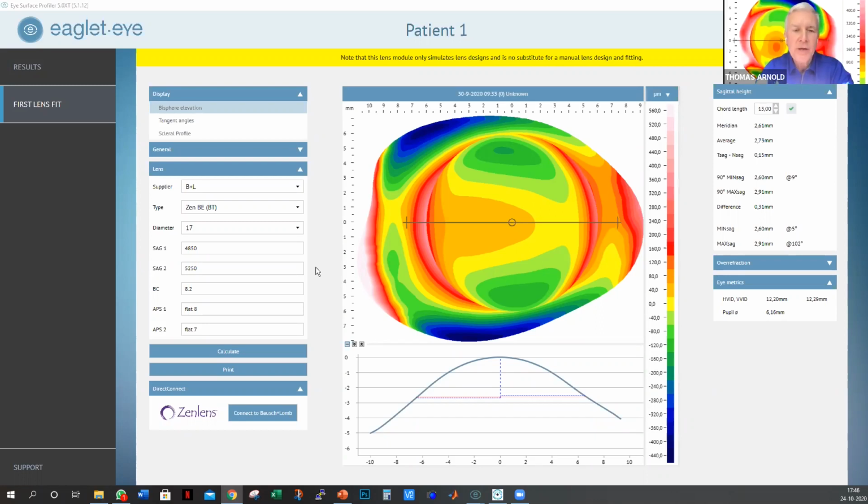Goes back to what I was saying earlier about time saver and efficiency. In our practice, we still have a regular general practice, but on Mondays and Thursdays, I devote those days to scleral patients. And as I said, they get harder and harder. And every 2 or 3 or 5 minutes you can save really makes a difference in your day. So it's a huge advantage.